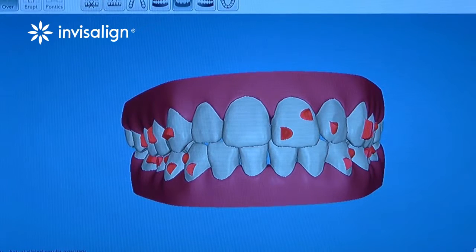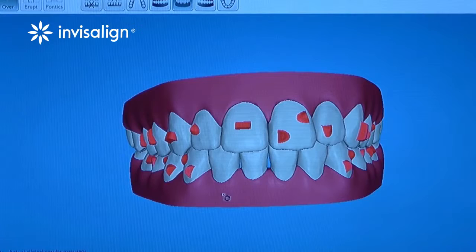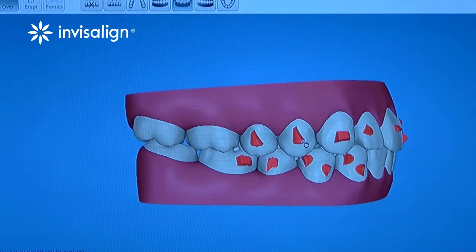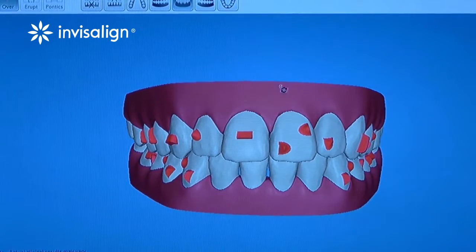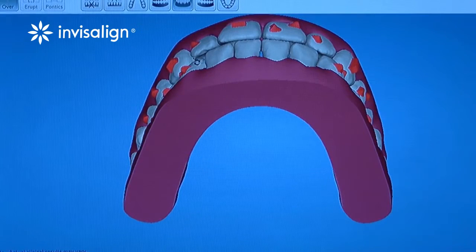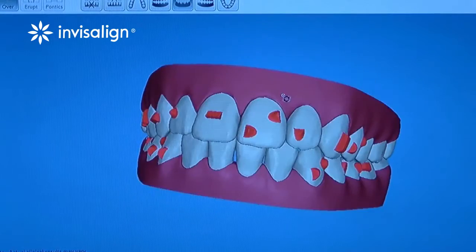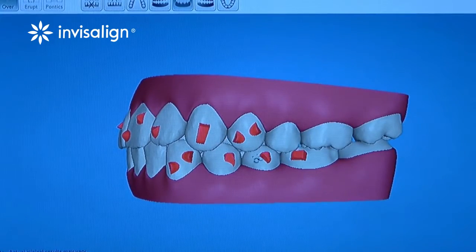And you can see the teeth aligning, the bite is starting to open up if you just look at the front. In the end, if I pan to the side, it'll show you how her teeth fit together, and they fit together beautifully on the side. We can look at it from a frontal view. The midlines are corrected and even, as we like to see. The bite relationship here in the front is perfect. And if we look at the other side, her bite relationship is normal and corrected as well, so everything fits well.